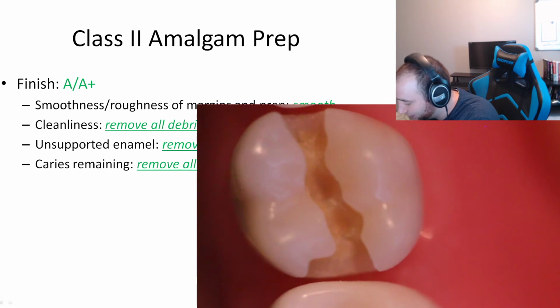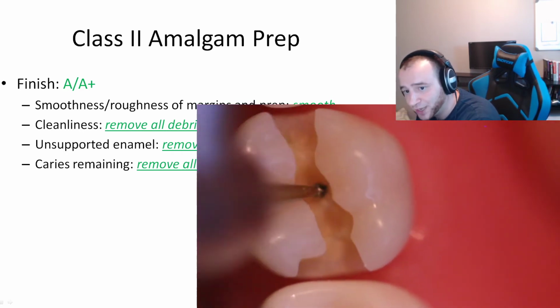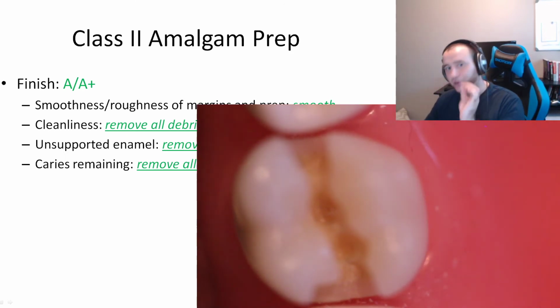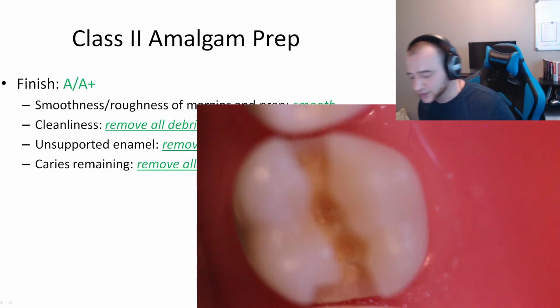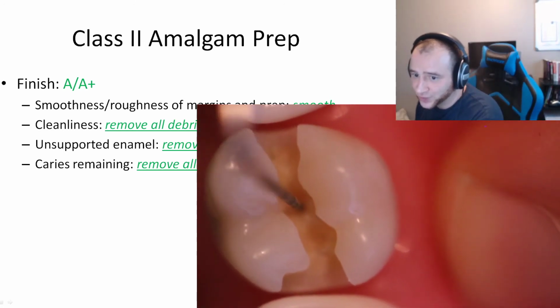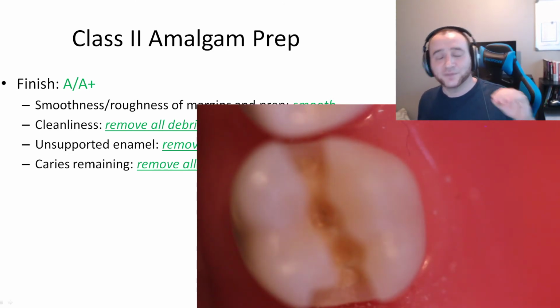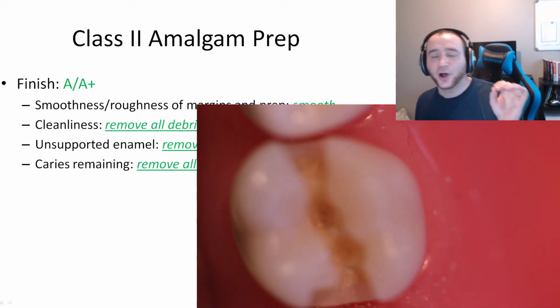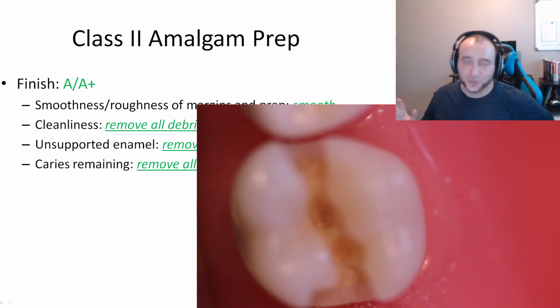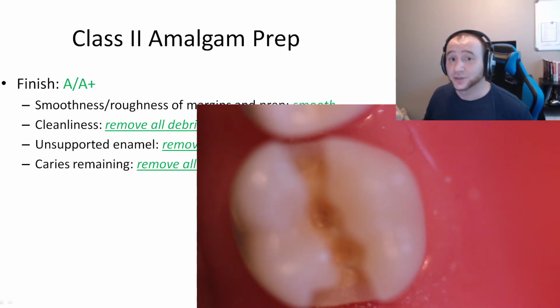There's a catch. Sometimes with this burr, because there's no water coming out from it, when it's spinning and you hit here, you'll find that it leaves little dark spots. Sometimes, okay, not always. And sometimes even with your probe, let's say you're scratching, you might scratch a surface and leave a dark spot. Now, what if the evaluator looked at that dark spot and thought it's caries? That's it, you're done, it's E. Caries you can't mess around with. It's either an A+ or if you leave caries, it's an E. There's not even a D.